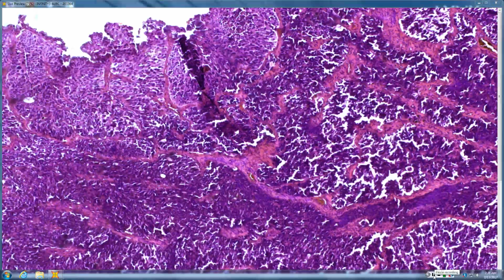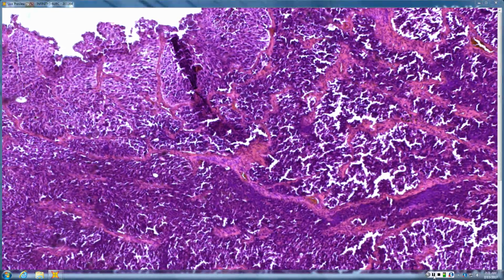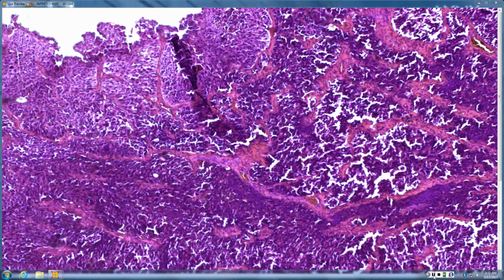So you see something that is somewhat blue and trabecular. So you mentioned possibility of Merkel. Does Merkel usually have visible cytoplasm? No. And do you see visible pink cytoplasm here? I do. So, certainly neoplastic, certainly a trabecular type pattern, maybe a little more cytoplasm than you would expect for Merkel. So we can go a little higher.